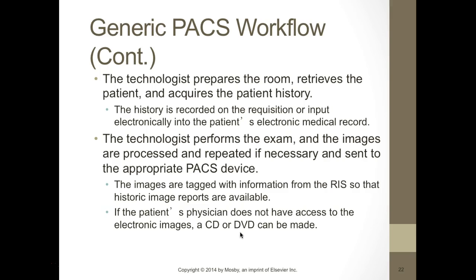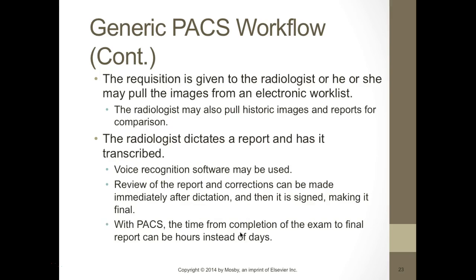The technologist performs the exams. The images are processed, repeated if necessary, and sent to the appropriate PACS device. So the images are tagged with information from the RIS, so the historical image reports are available. If the patient's physician does not have access to electronic images, you can burn a CD or DVD. Sometimes we can even print paper copies for the patient to take, and we'll talk about that.